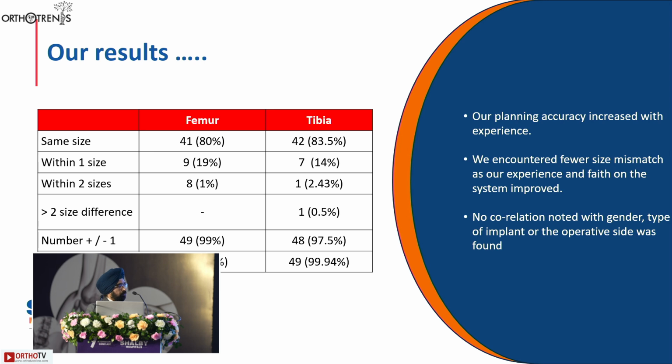In our study, the accuracy was to the tune of 80% in the sizes. With plus or minus 1 or plus or minus 2 sizes, we can get about 100% results.